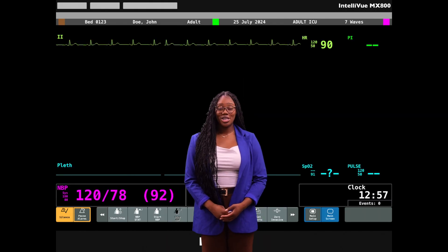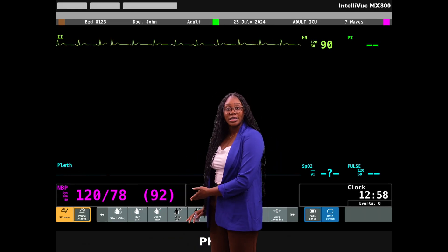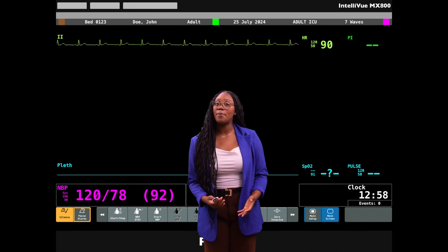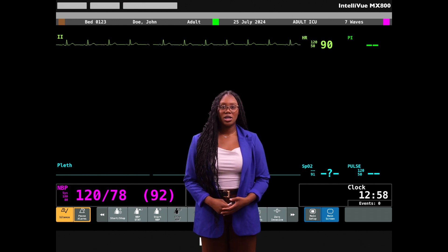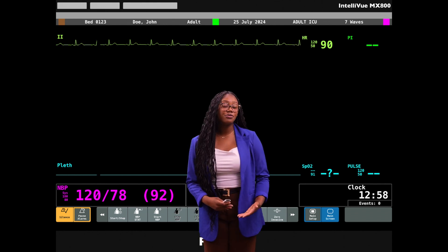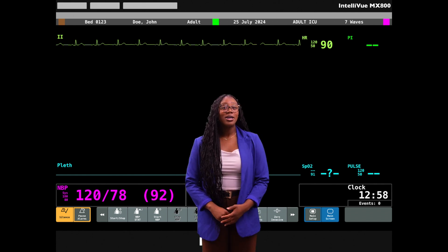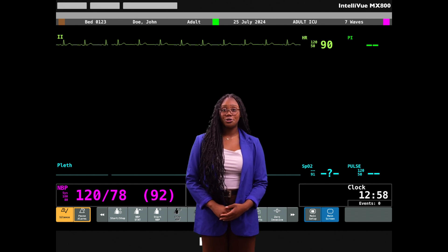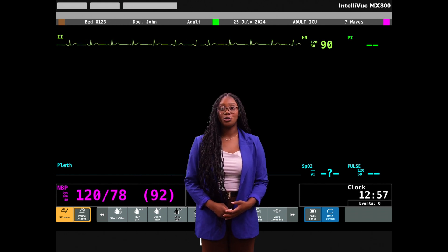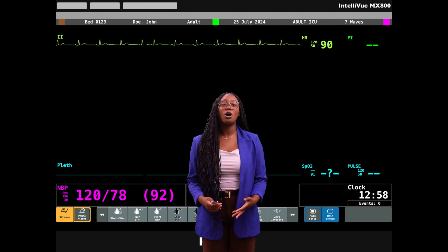Next, we'll move on to blood pressure. You can initiate collection by pressing the start button. The normal adult blood pressure is usually around 120 over 80, but always remember that context matters. A normal blood pressure may vary based on age, patient size, health conditions, and other factors. The noninvasive blood pressure machine may be programmed to measure blood pressure at specific intervals like every 15 minutes, 30 minutes, or hourly. The monitors can also be programmed to alert staff if readings fall outside preset parameters. Common blood pressure reading traps include white coat syndrome, recent exercise or caffeine intake, improper patient positioning, or talking during measurement.